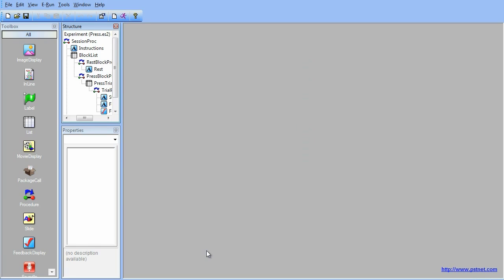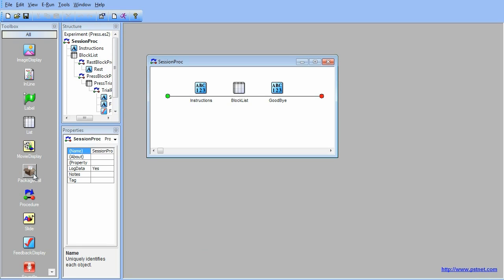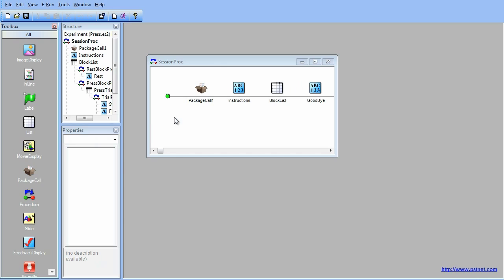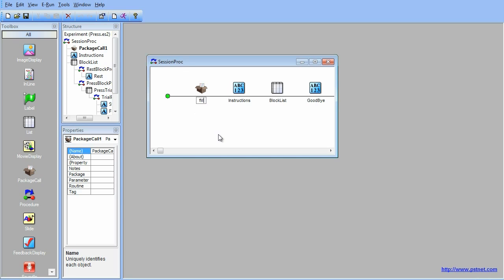Now we will add a few package calls to the experiment. Open the Experiment Session Proc and drag a Package Call Experiment Object just before the Instructions Text Object. Rename this package call fMRI session init. This is done by clicking on the Package Call Experiment Object, pressing F2, and then typing fMRI session init.